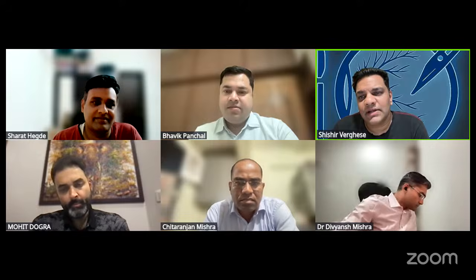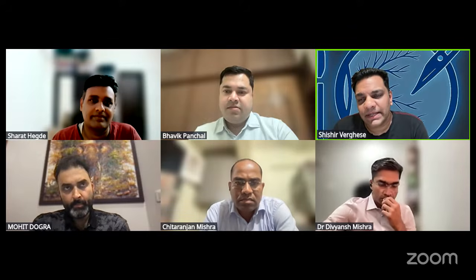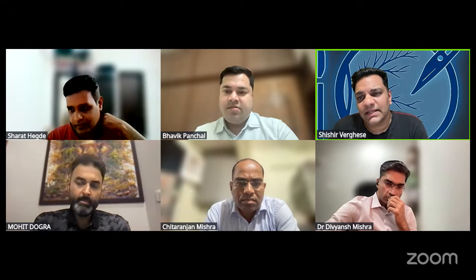Shishir, your thoughts on larger macular holes? Primary surgery is always an ILM flap. If it's a larger hole, probably I'll use Dr. Chintan's technique, put a PFCL and then do a larger temporal flap. Mobilize more of the ILM from the periphery and put a larger temporal flap. But if it's a resurgery where the hole has not closed, then I'll go for an autograft.